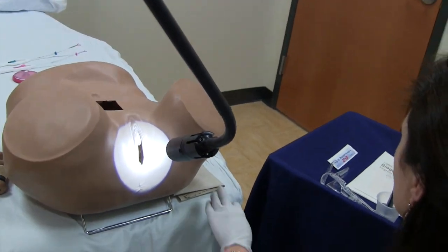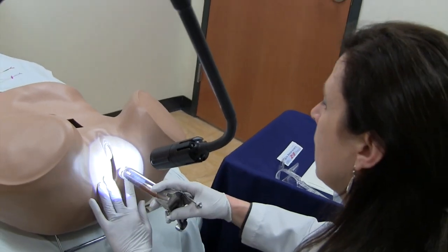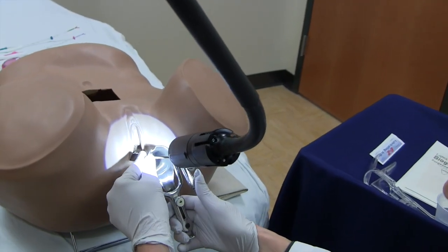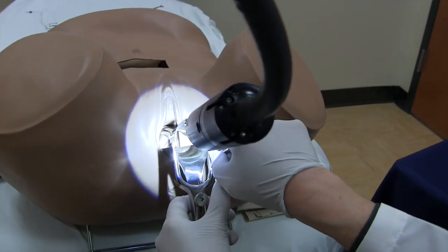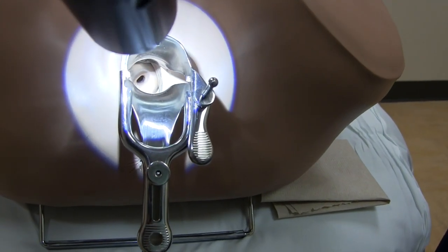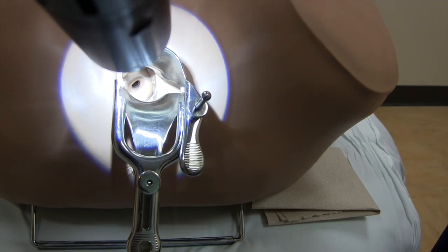For this particular one, I am just going to use a little bit of warm water for the sake of time and the insertion. One thing about ZOE is that her cervix is fairly superficial, and using the light one can visualize the cervix fairly easily in order to be able to perform procedures — in this case, the IUD insertion.